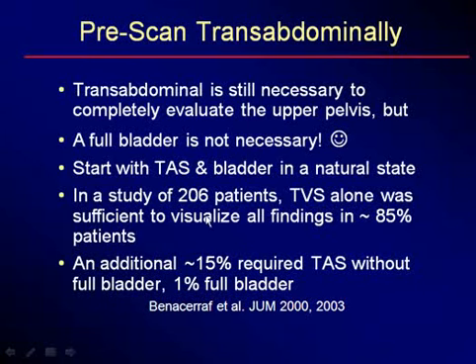We do have some evidence from an article out of Boston in a study that they did on 206 patients. When they did transvaginal alone, that was sufficient to visualize all of the significant findings in about 85% of patients. That meant that an additional 15% of patients still required a transabdominal scan without a full bladder to get the information. Only 1% of them actually required filling of their bladder.